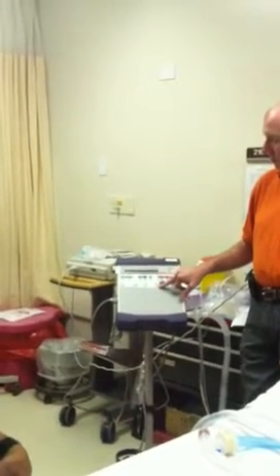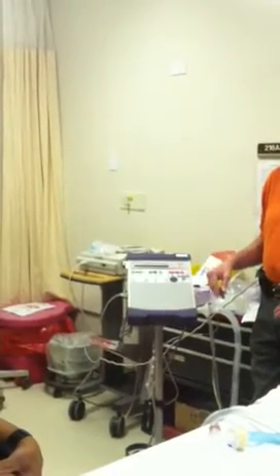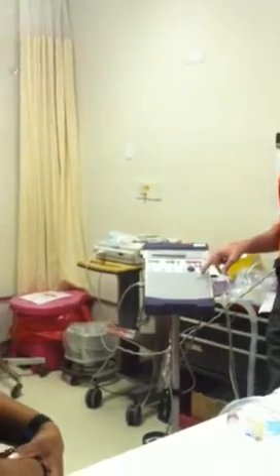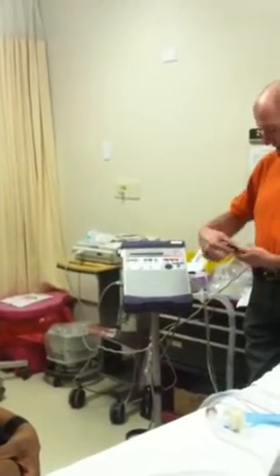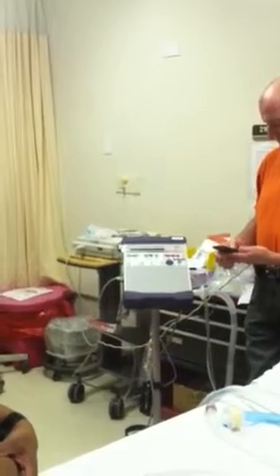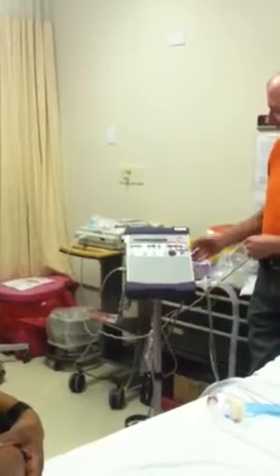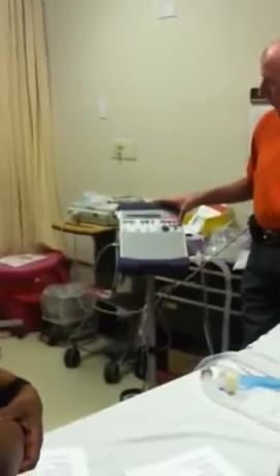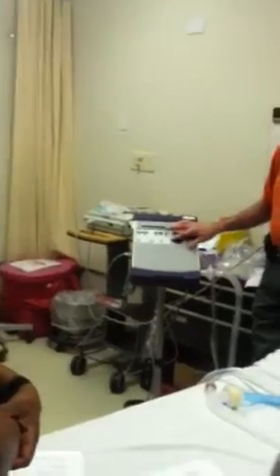Family, maybe this patient's been at home and they know just a little bit about the vents, and they're like, well, I know at home he was on a tidal volume of 700. Well, when the respiratory therapist walks out, I'm going to go ahead and change the controls. So we can actually lock them out if we want to. So that's what that's for. But we're not having an issue with it, so we're not using it a whole lot.